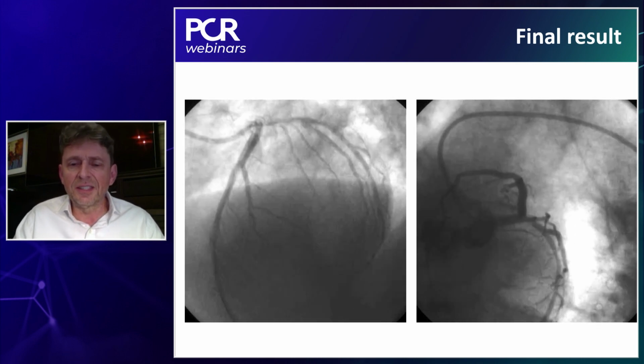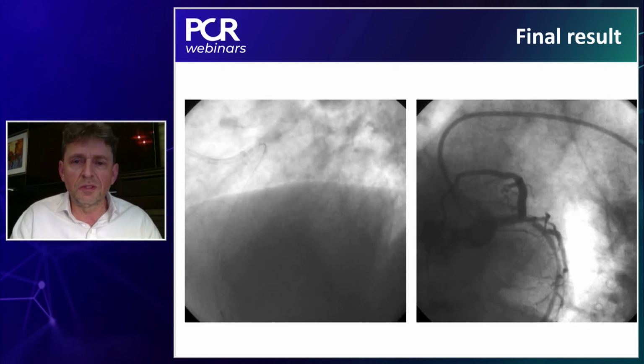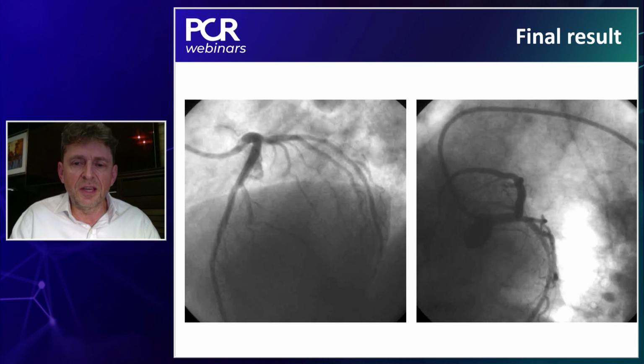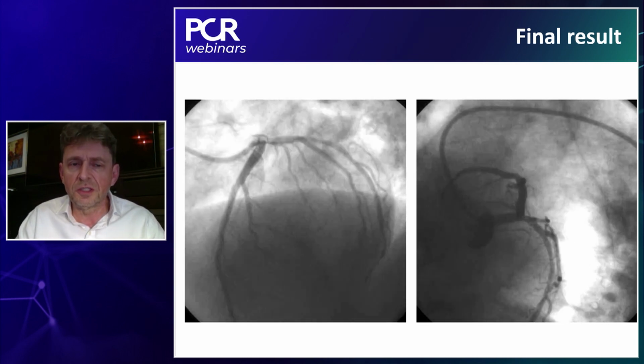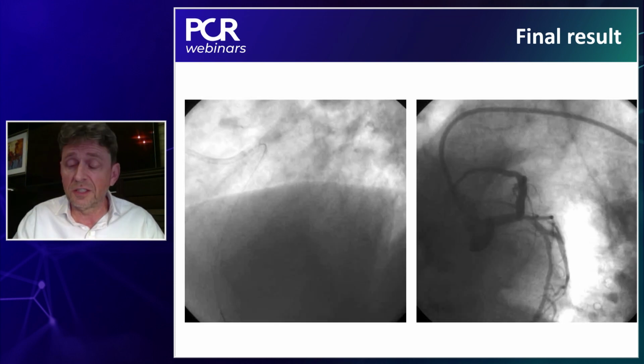And again, it's easy because we have just one lesion in one vessel. So I don't think there is any place for physiology here in this case, at least to make a decision of stenting.